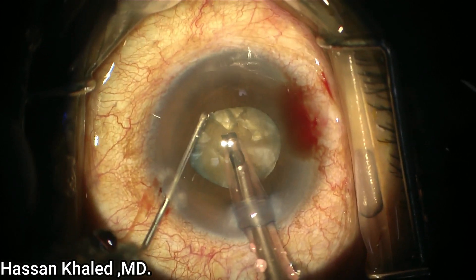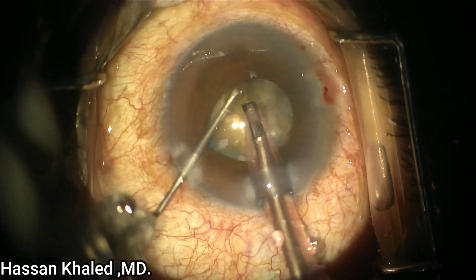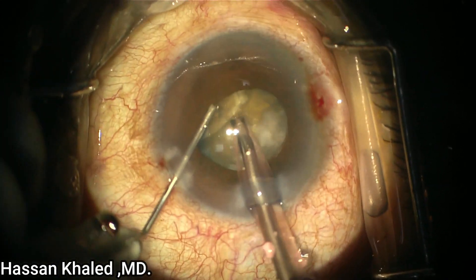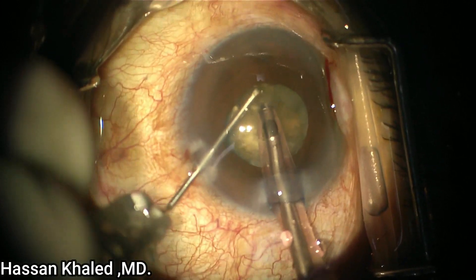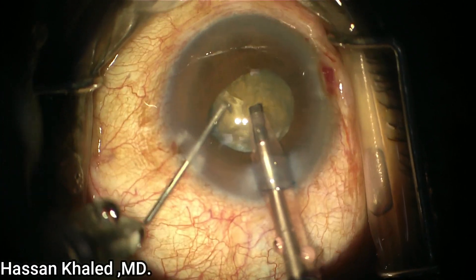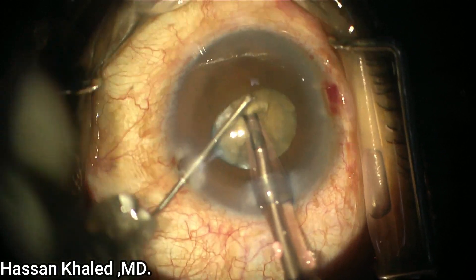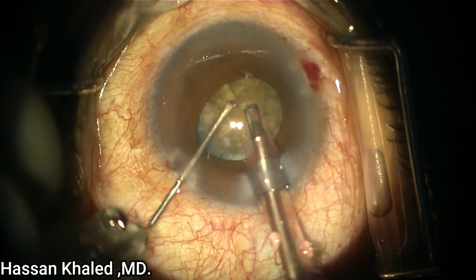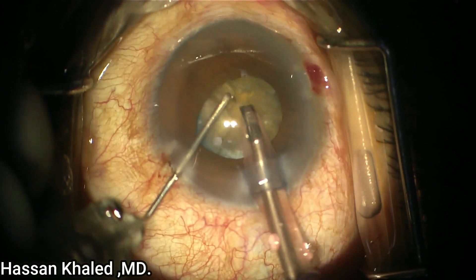I hold again and chop again. As you can see in this movement, I rotate the nucleus, then I hold the part that I can see and chop it with the sharp 27-gauge needle. At this point, it's very important to be careful not to catch the iris while you are doing chopping of this dense cataract.